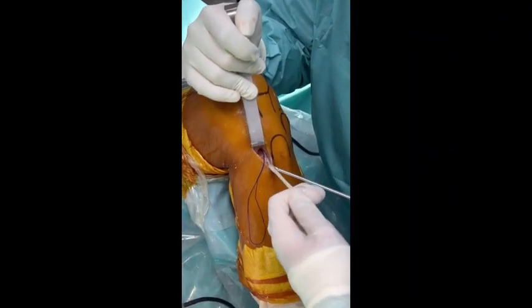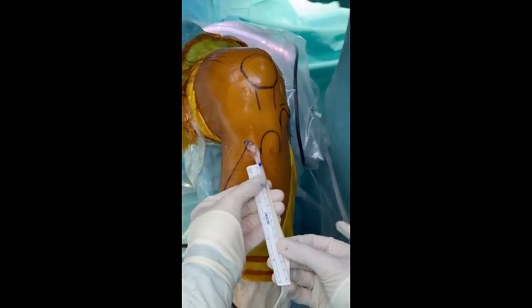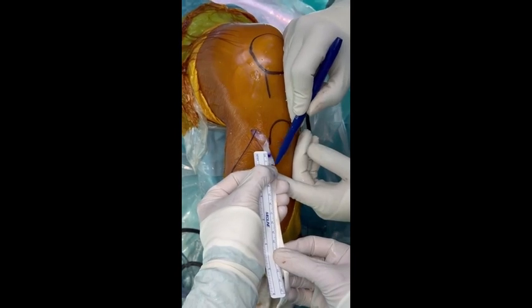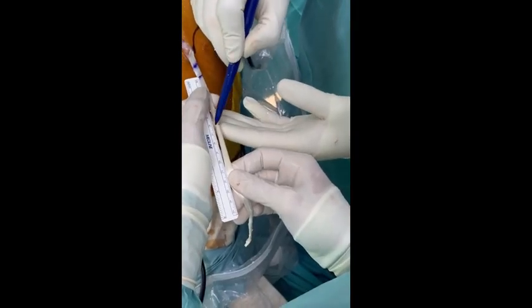The semitendinosus is measured from its insertion to the entrance of the tunnel and marked. Following this mark, another 2 marks are made at the points: total length of the tibial tunnel minus 15 mm, and total length of the tibial tunnel plus total interarticular length plus femoral socket.